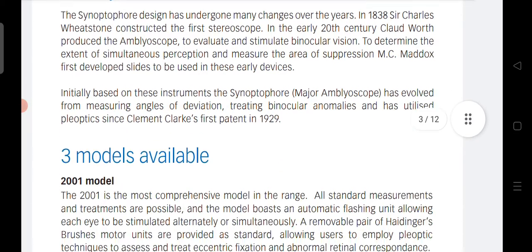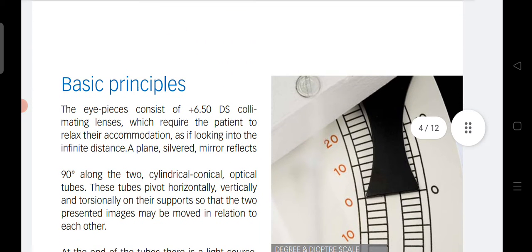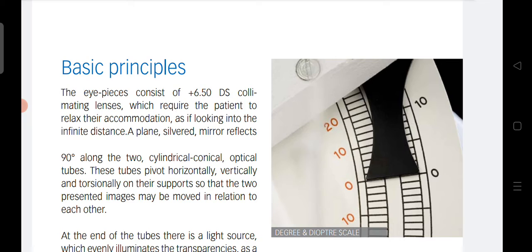The basic principles of the synaptophore: the eyepieces consist of plus 6.5 diopter collimating lenses, which require the patient to relax their accommodation as if looking into the infinite distance. So the synaptophore is adjusted so that you are looking at distance. When measuring fusional vergences or doing other tests for near — such as negative or positive fusional vergences for near, or a cover test for near — you need to add a minus 3 diopter lens in both eyepieces.